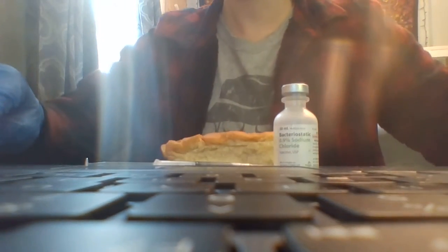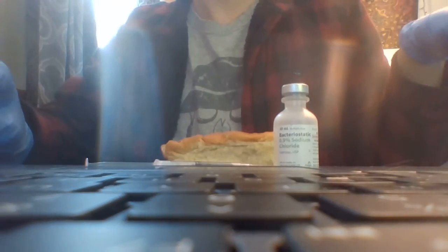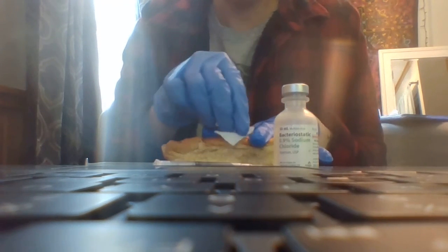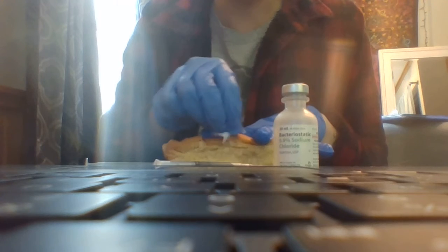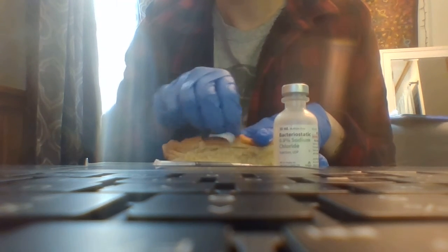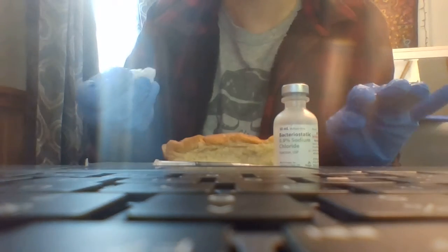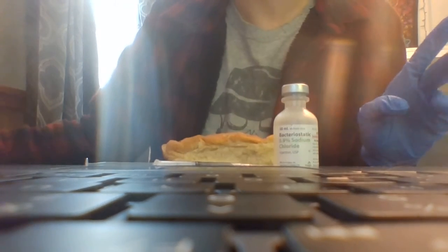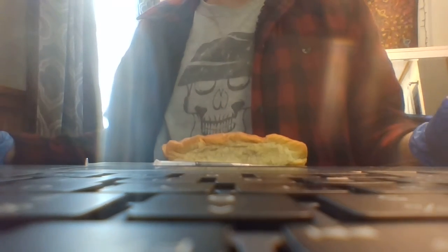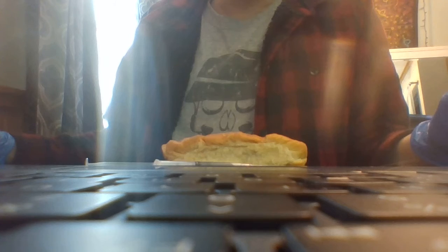I have this hot dog bun to do that. So I don't like hot dogs anyway. Okay, so I am going to clean the skin for 15 seconds, moving in an outward motion. And I'm going to allow that to dry. Okay, so that's dry. I never took my eyes off my medicine, by the way.